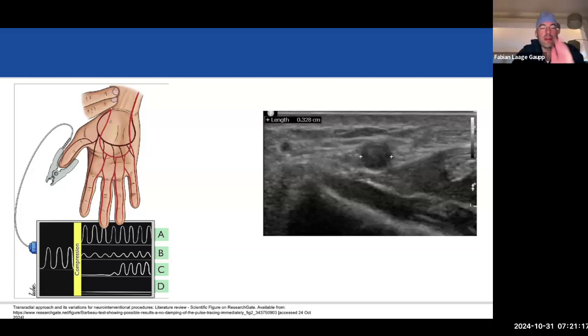Yeah. And an additional disadvantage of the radial access is that, because you're working close to the carotid arteries, there's always a theoretical risk of causing stroke, right? So for instance, if you were by accident to introduce air or there's a clot forming, that would go directly to the brain. And this is why we typically do a left radial access. The subclavian artery comes off last from the aortic arch, right? So when you're coming through the left subclavian, you can go directly down the descending aorta, and you don't have to cross the common carotid arteries.